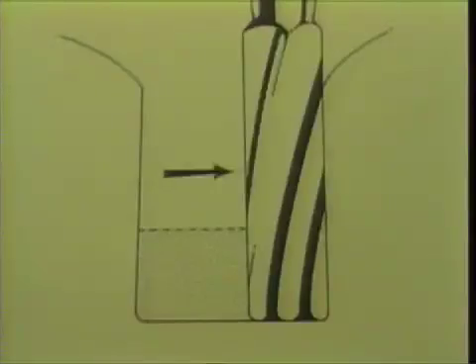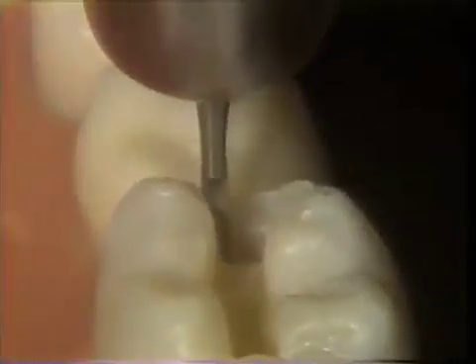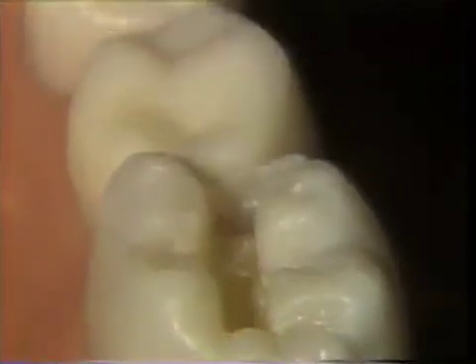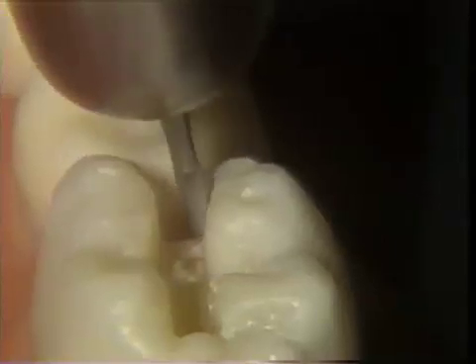The diagrammatic example will now be demonstrated on the extracted tooth. The burr is placed into the prepared tooth, very lightly contacting the cervical floor, and as the burr is moved buccally, it is positioned so it will produce an inverse taper on the proximal wall. The lingual wall is prepared in the same manner.